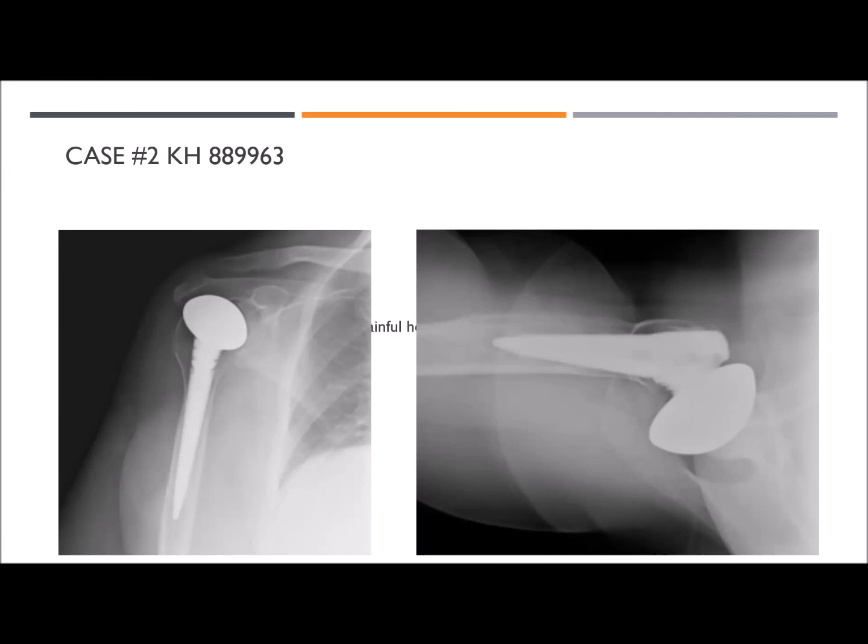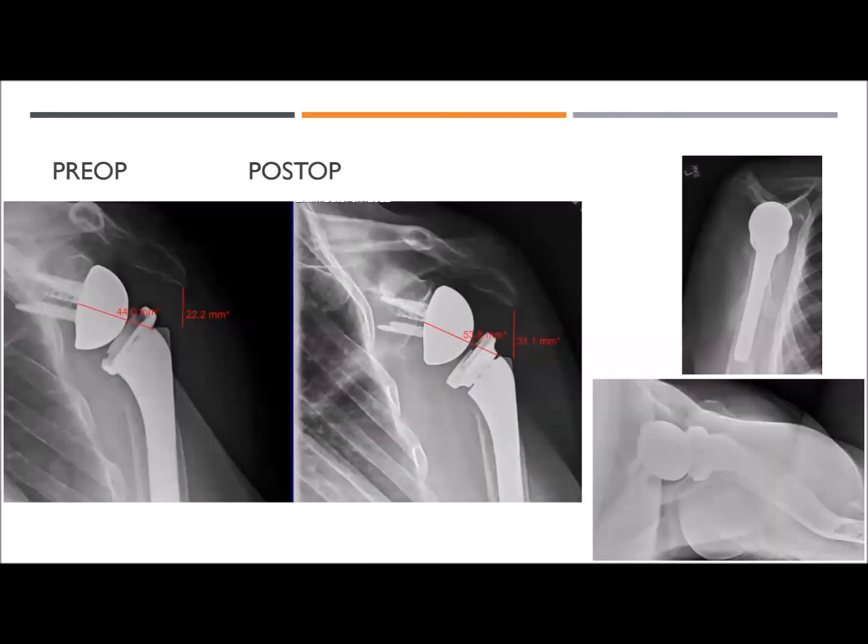This would have been his 4th or 5th surgery. I felt that putting in a structural tibia or femur graft laterally to recreate the greater tuberosity would have been risky, potentially for infection, in this particular patient. So this is what we did, and at 3 months he's doing pretty good. So hopefully that sticks for him.